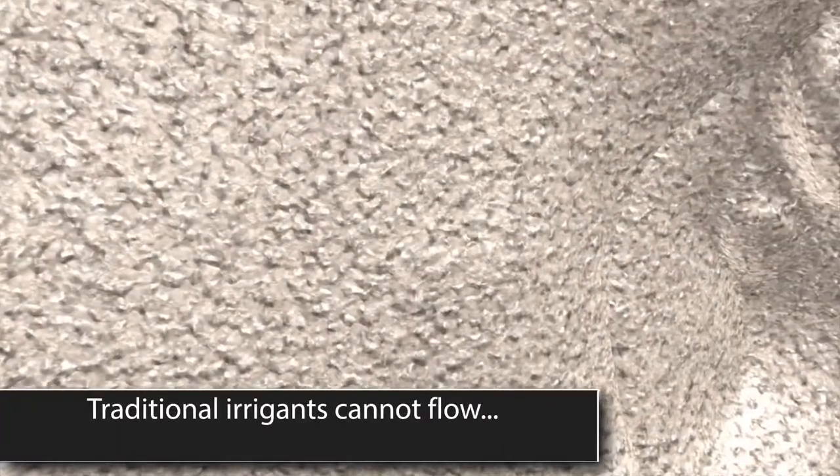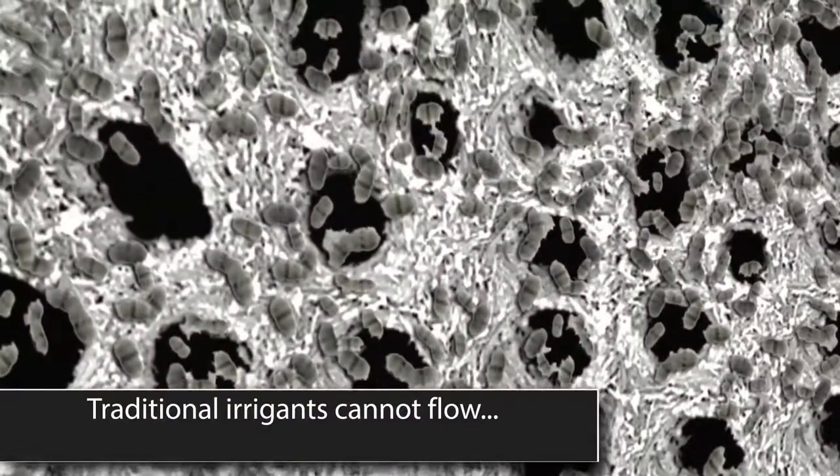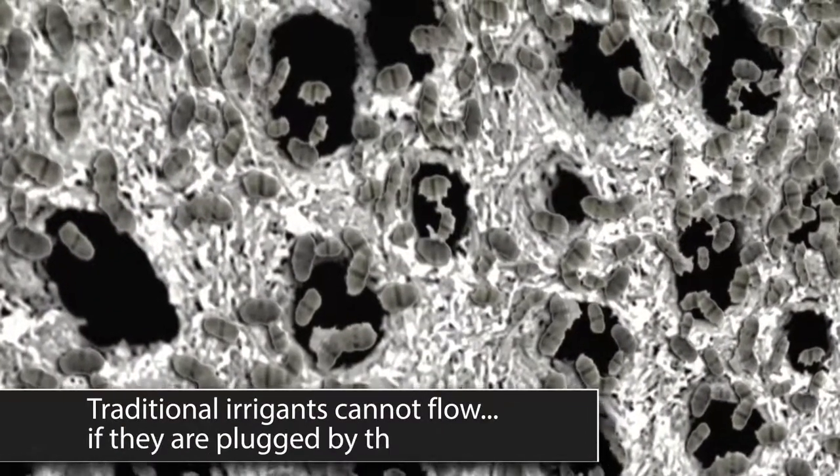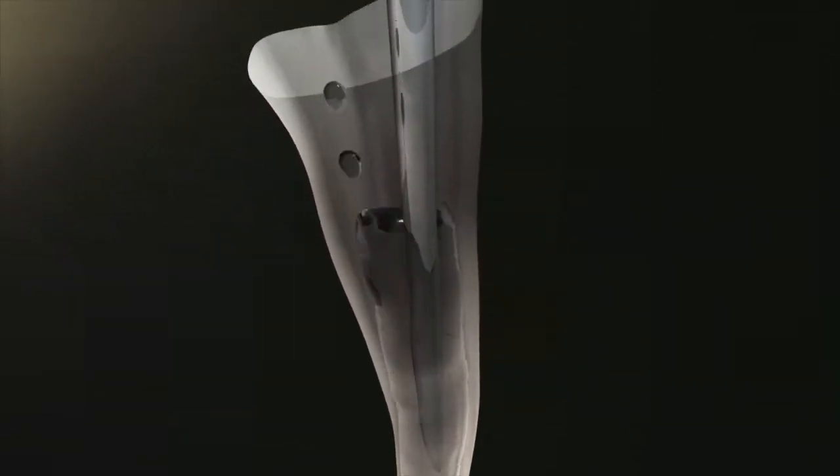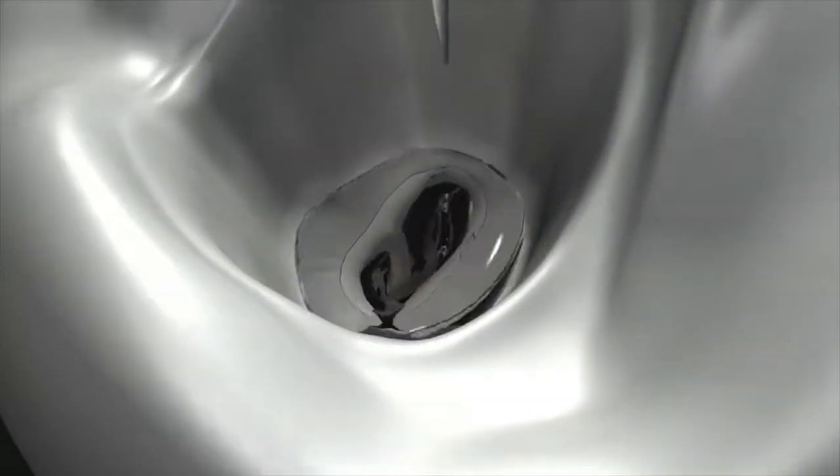Take a look at how this powerful combination prepares the way for a three-dimensional obturation of the root canal system. Even the most trusted, time-tested irrigants must physically contact bacteria in order to kill it. Traditional irrigants cannot flow into tubules, lateral canals, or isthmuses if they are plugged by the bacteria-harboring smear layer. If your irrigation solution cannot flow into these blocked areas, your filling material will never reach them either, and the bacteria will remain.